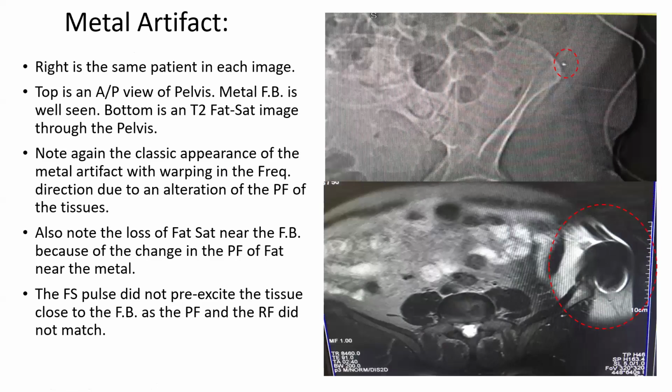Okay, here's somebody with metal in the pelvis. What artifact is demonstrated here? Here's that pile up, so that's metal. Or if you go, oh, that's metal, but what if the closest answer is susceptibility artifact? Tell them what they want to hear, okay?